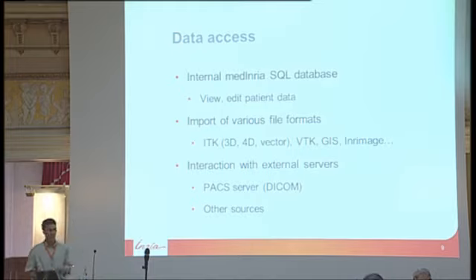It's not really visual, but we have an internal MedInria SQL database where you can view your patients, edit them, see their age and some of their information. You can import a lot of various file formats in MedInria, formats supported by ITK, by VTK, some other more specific formats developed at INRIA as well.